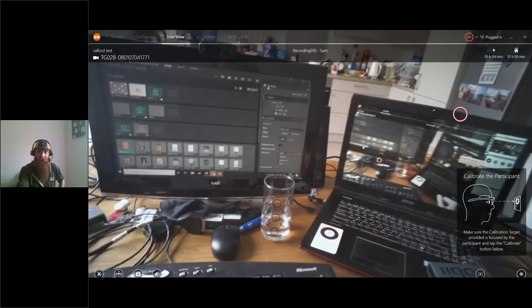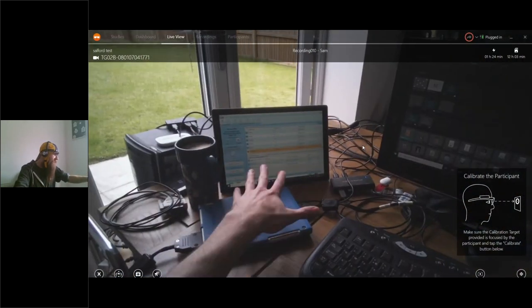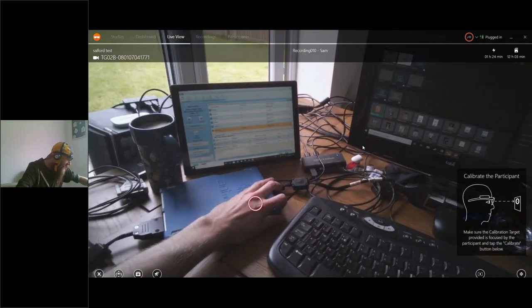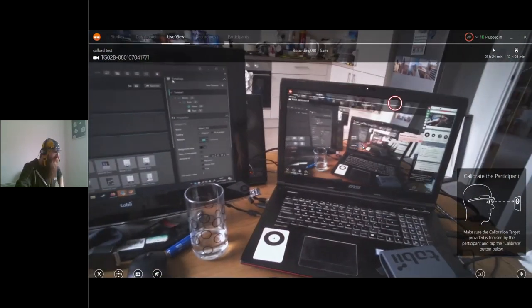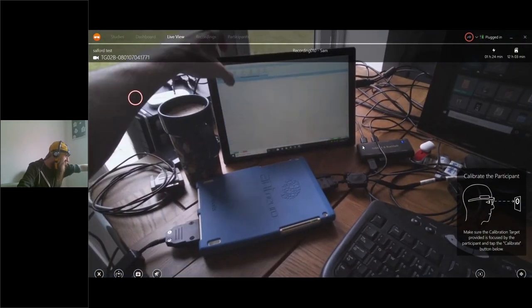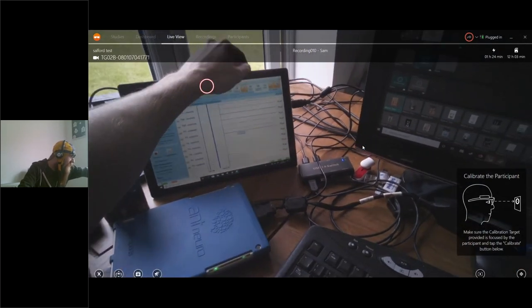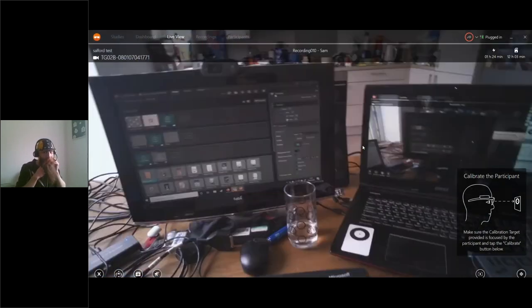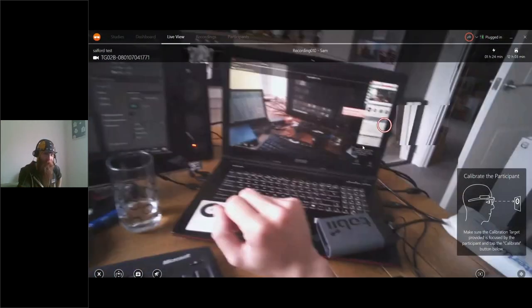So as you can see, I've got my eye tracker PC over here. We also have an EEG device somewhat ready to go over here. I've been hooked up for a while, so I can't guarantee that the impedances will be great. Let's just get the amp on and start displaying something here. And it probably would help if I did up my chin strap, but I'm not sure that there's time for me to worry about the data quality right now.